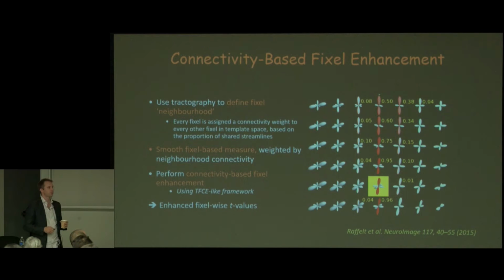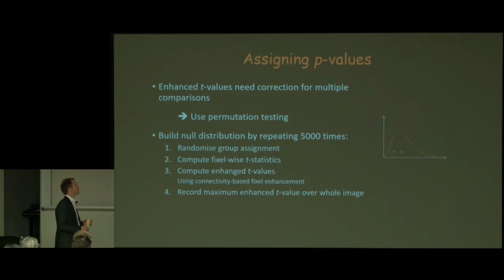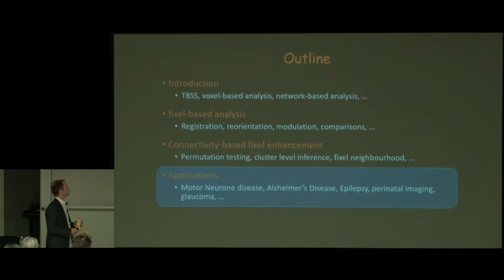So it's entirely possible to have non-significant voxels or pixels halfway down there, but other significant ones down the track, and yet they provide support to each other. So you can have an interruption in the t-values, and yet still have enhancement, which is quite neat.